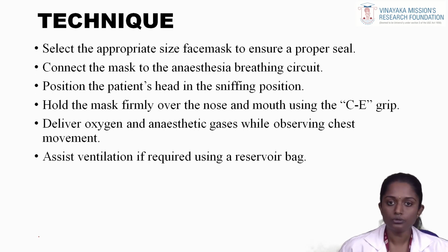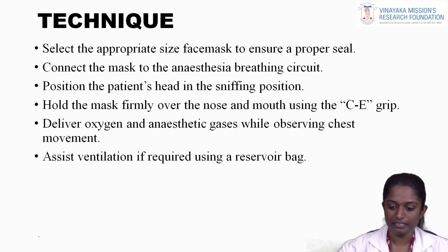Then the technique, how to use this face mask. First we have to select the appropriate size for the patient. Then connect the face mask to the anesthesia breathing circuit. Position the patient, that is, the head in the sniffing position. Hold the mask firmly over the nose and the mouth using the C and E technique.